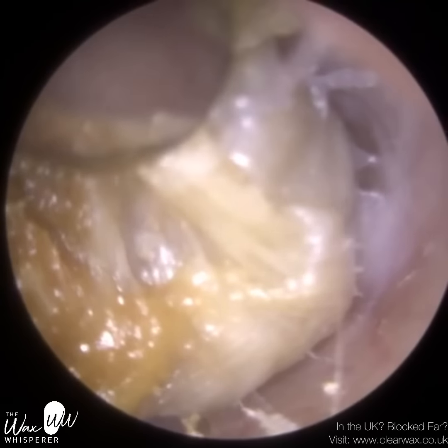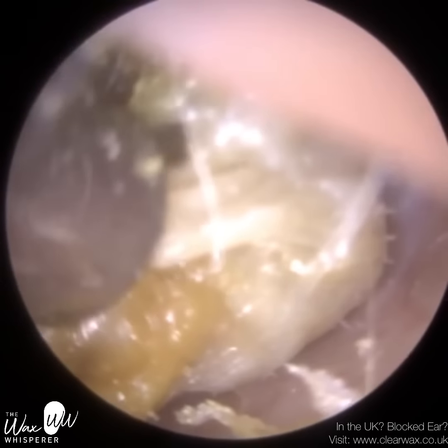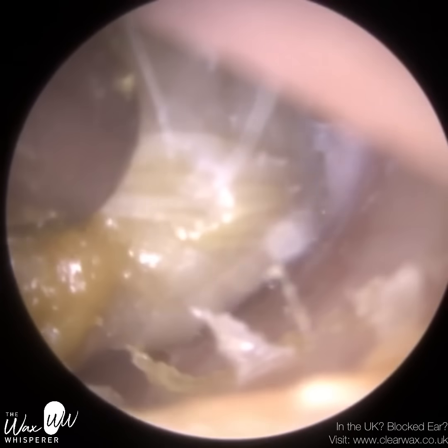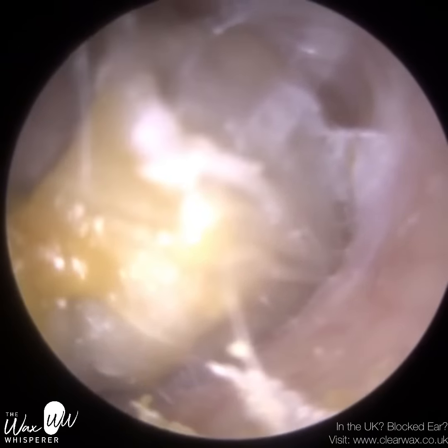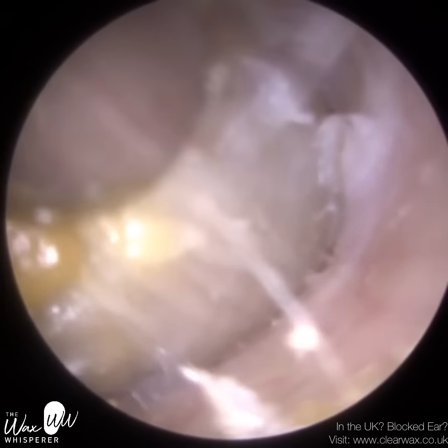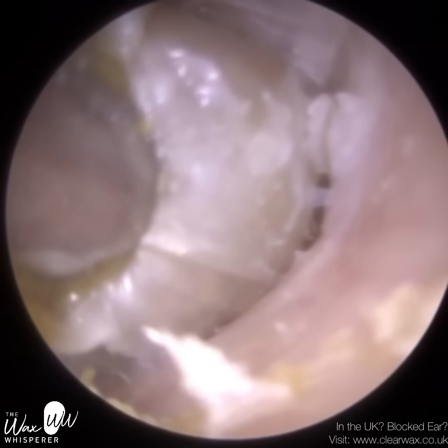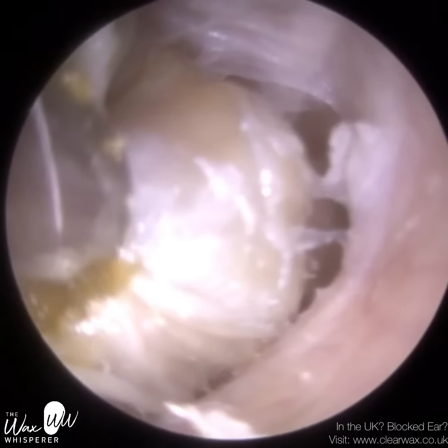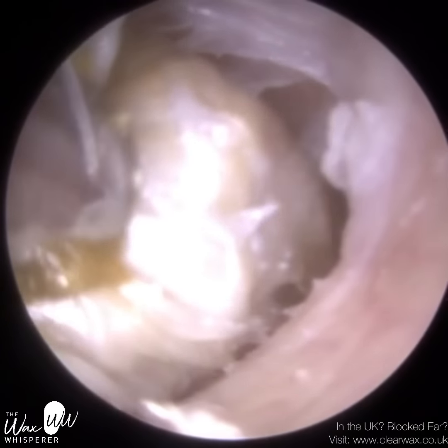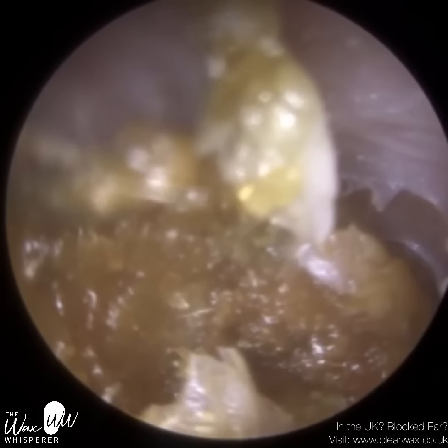You can in some way compare it to a very small puncture, a slow puncture if you like, of your tyre, and when you're driving the car, some of the air will come out, and it's almost like a valve. You can see the perforation is so small that on some occasions the fluid is almost sealing that hole, but on other occasions some of it's being pushed through.